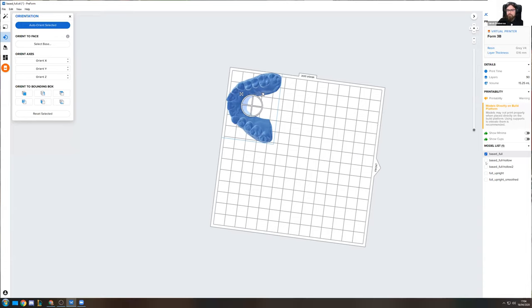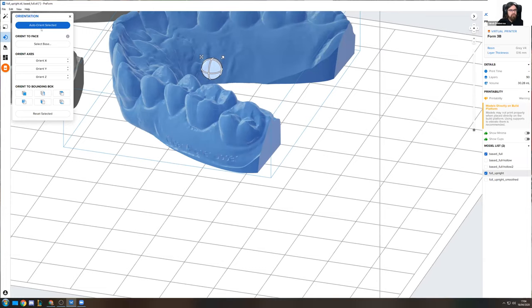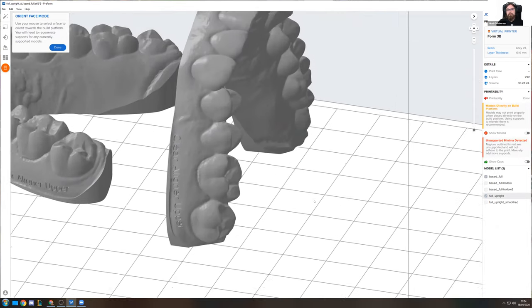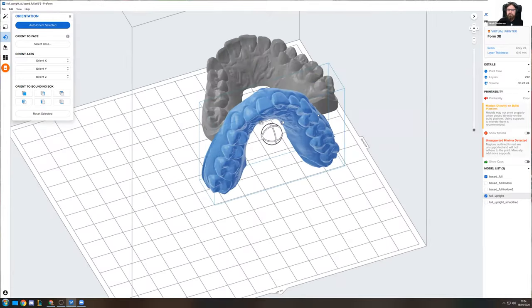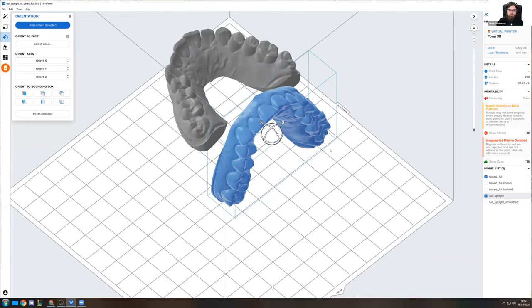But the other big one that you can do is if you have a model that you cut off at the end with a planar cut, just like this one right here, you can also just use the select base feature to just go in, and then you can also put it on the backside, and then you can print these models upright like this. This is also a variant that you can do. Most likely we will be adding a couple of supports, which I'm going to show you in a second. But as you can see right here, this takes up much less space on the build platform itself. So you can feel free to add quite a lot more models right here. The print will take longer, but as you can also just leave the machine running overnight, this is something that Eliza will show you a little bit later on.